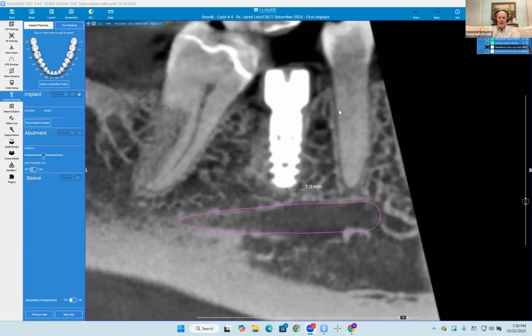Yes. So the Y dimension means that, let's say that's a 10 millimeter implant. When you put a 10 millimeter implant in, you have to drill more than 10 millimeters, usually 11, possibly 11 and a half millimeters. Always remember that. That's why you never want to be less than 2 millimeters from the nerve. So if you're 2 millimeters, even with the Y dimension, you'll never enter the actual canal proper.